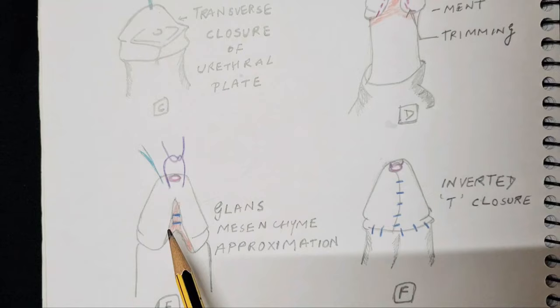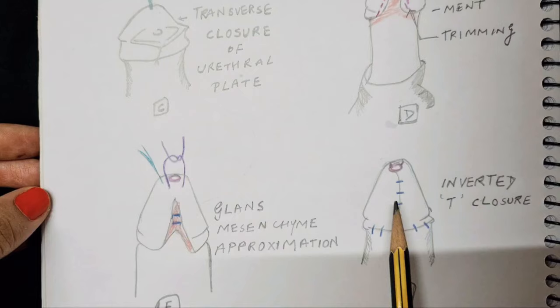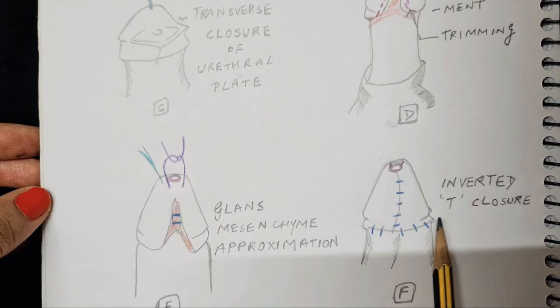These steps are mainly done with Vicryl sutures, though some prefer PDS as well. Once sutured together, this gives a more conical shape to the glans. After that, the overlying incisions are closed, giving a final picture of an inverted-T with the urethral meatus at the tip of the glans, which is the desirable position.